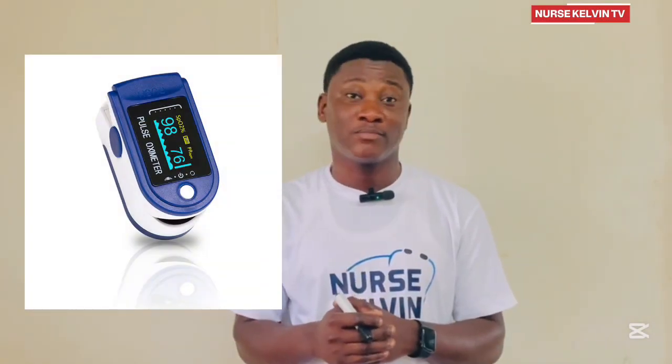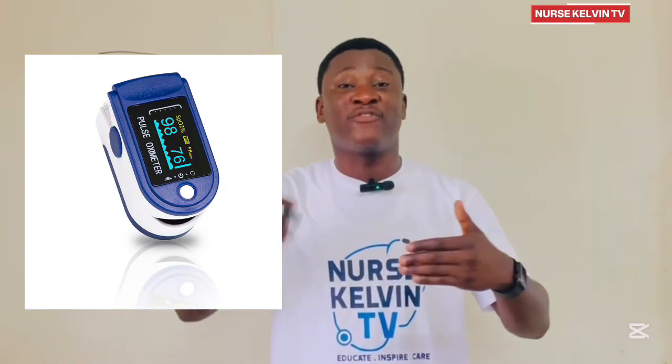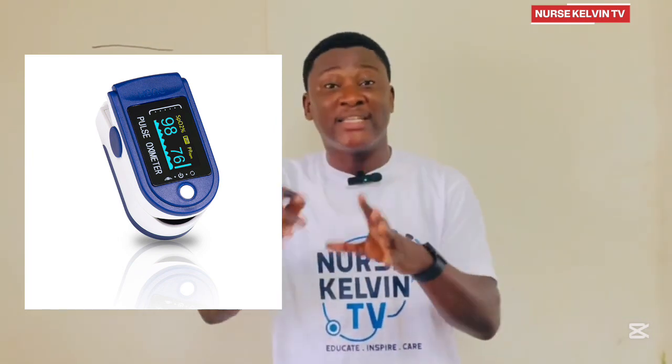Then the next one that we are going to talk about is the pulse oximeter, which is used to check the SpO2. This device measures the oxygen level, and it helps us to know the level of oxygen in the patient. Then also it helps us to know the effectiveness of the respiratory interventions. The normal range for oxygen saturation is 95 to 100. You need to know this so that you won't cause any problem to the patient.